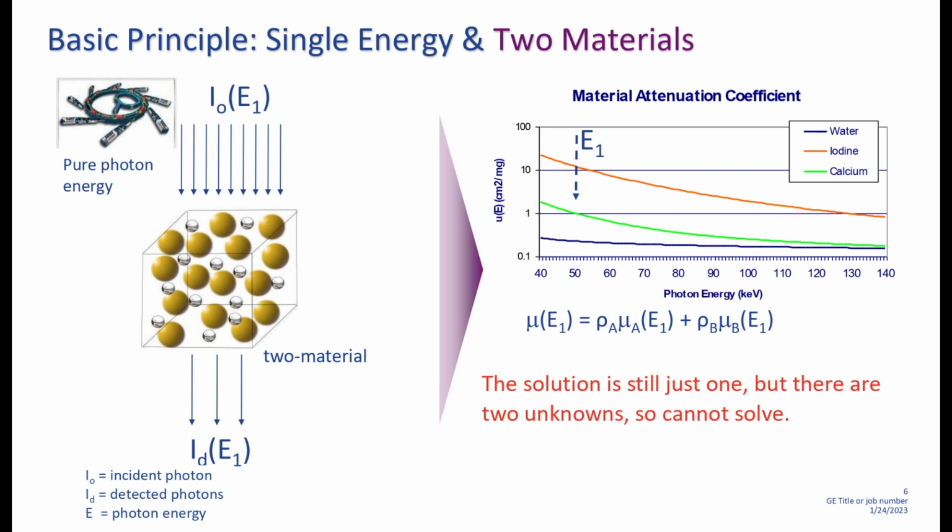It will be affected when there is osteoporosis, because the material is changed. It is not normal bone. Calcium is there, along with that you are having other material also. That is exactly what the attenuation curve will show. It will say the attenuation is reduced. Right? Now this is okay. Fine, great. One material, one energy, we can easily measure and say this is this material.